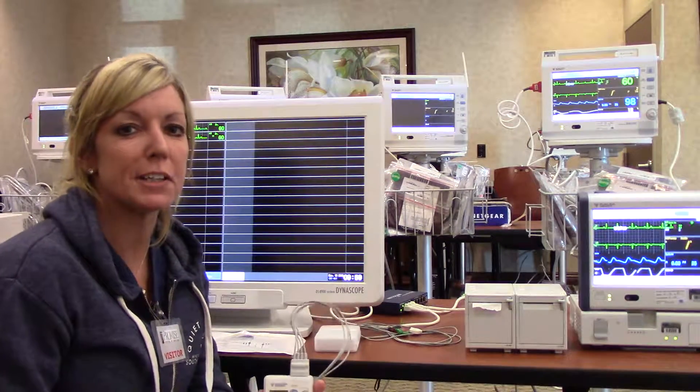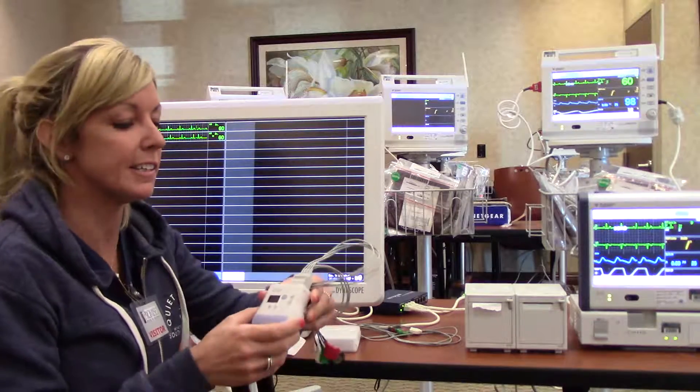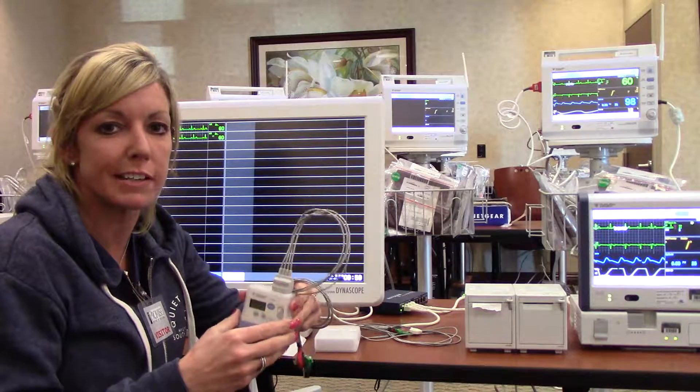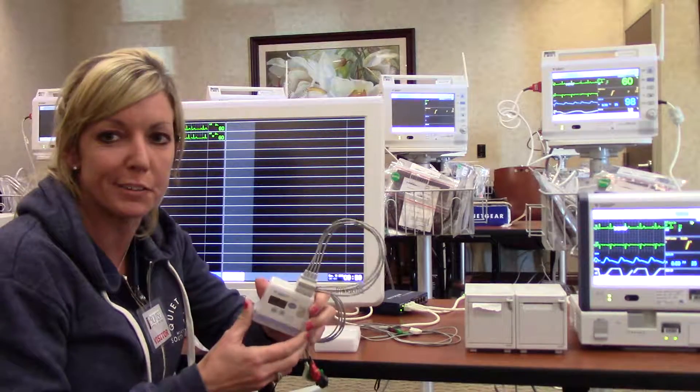Hi, we're here to talk about the equipment from Fukuda-Denshi: the telemetry monitoring units, the bedside heart monitors, the rolling stand heart monitors, and the central monitoring devices.